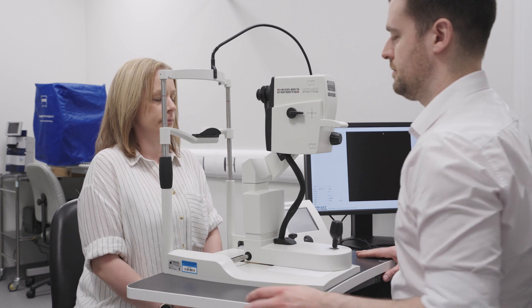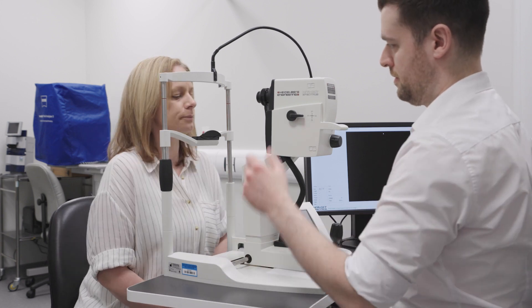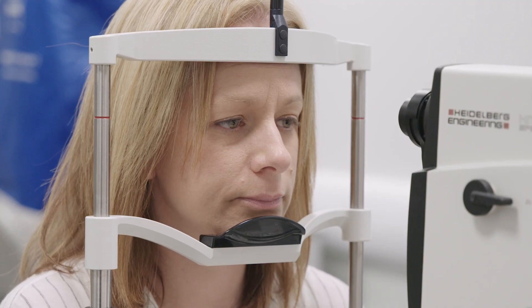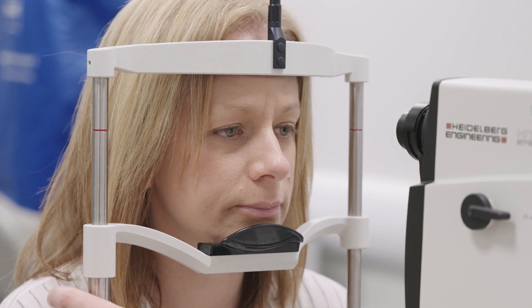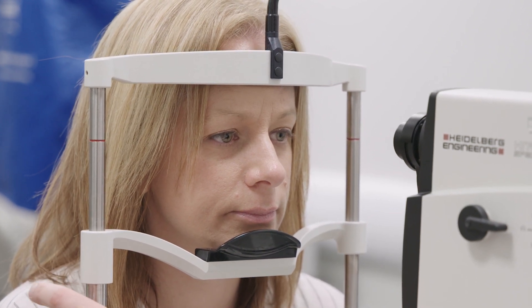Patient Setup. Before instructing the patient to place their chin on the rest, set the table height slightly lower. This will encourage the patient's forehead to rest naturally against the bar, reducing the likelihood of incidental head movement during the scan.